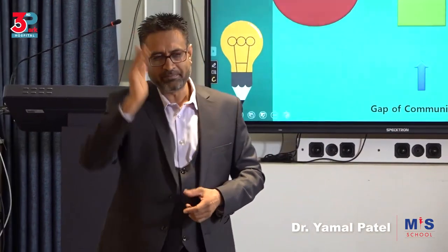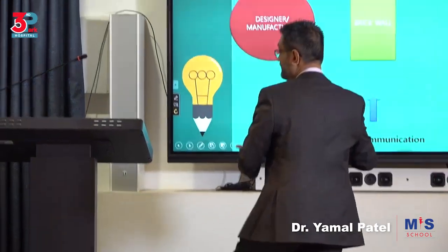Even, let's forget that, when you talk of a normal scissors or open surgery, are you being given different sizes because you're a size 6.5 and he's a size 8? So you see what I'm trying to tell you? Why are we assuming my hands will fit the scissors the same way as your hands will fit the scissors? You've understood? Now that's a problem, but it's a problem that is going to be difficult.